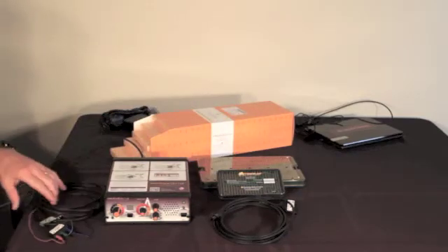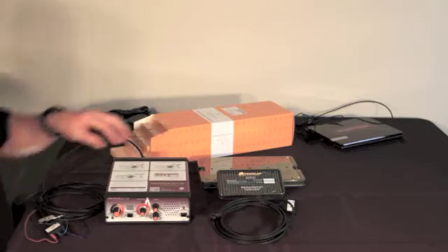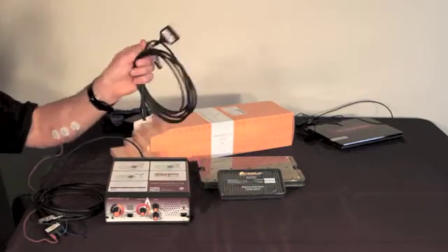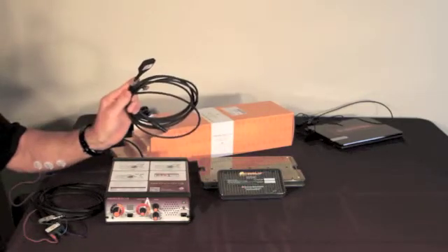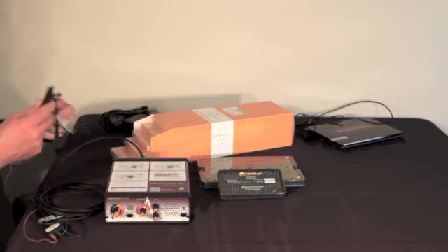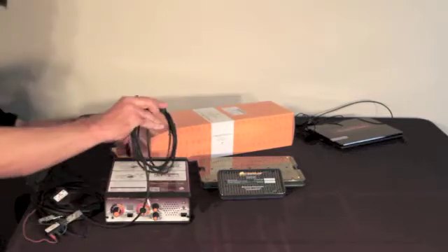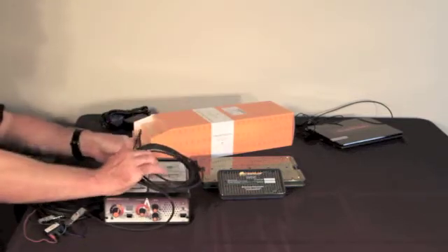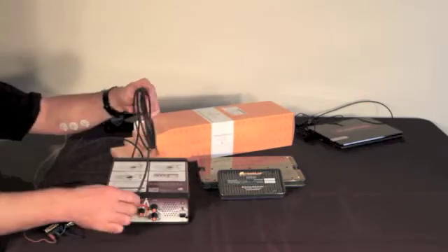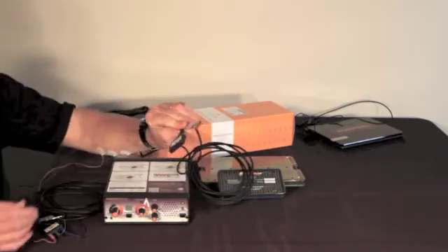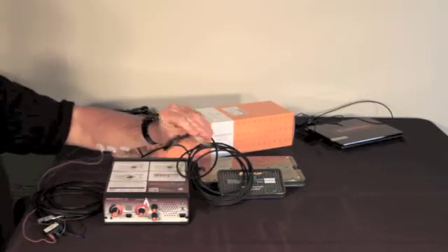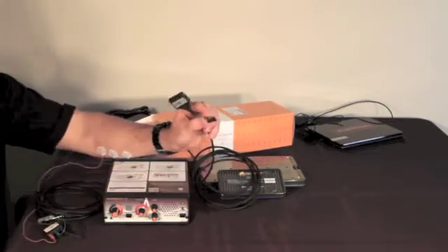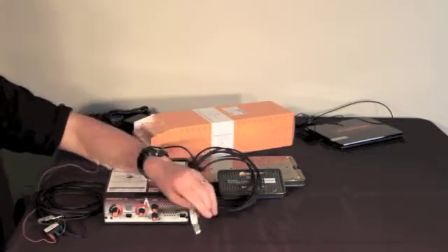With that done you can proceed on now to setting up the stimulator side, step 3. Plug this into the back of the machine and secure this cable near the patient's head just as you did with the EMG cable using this garment clip.